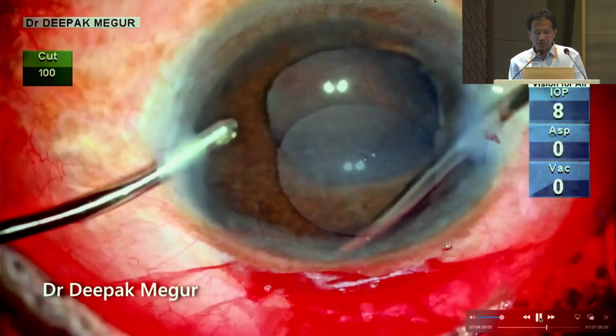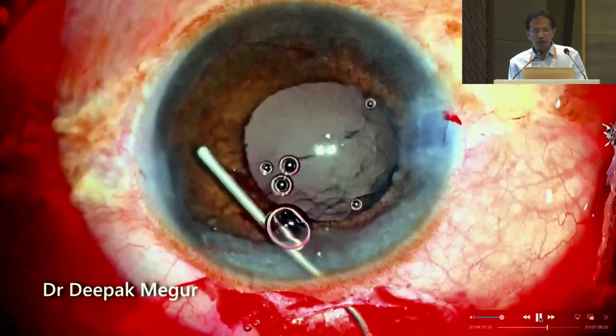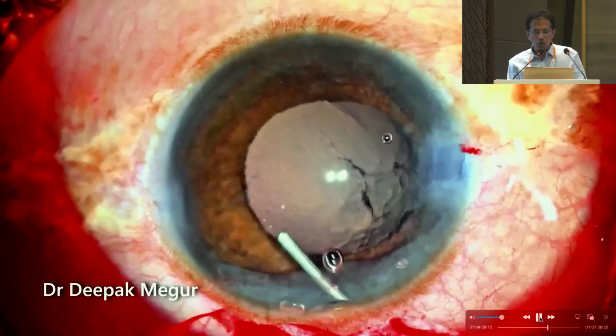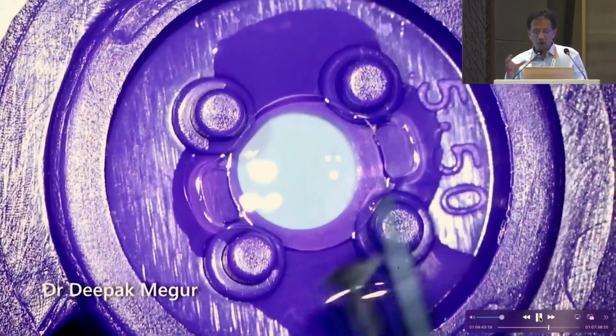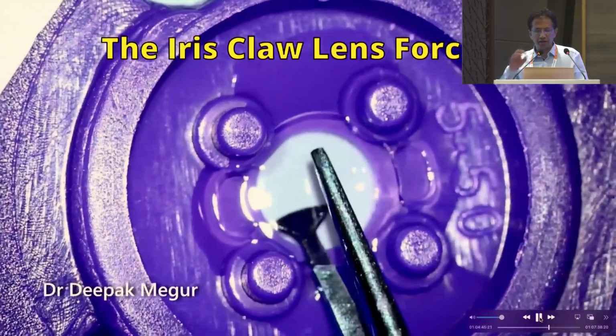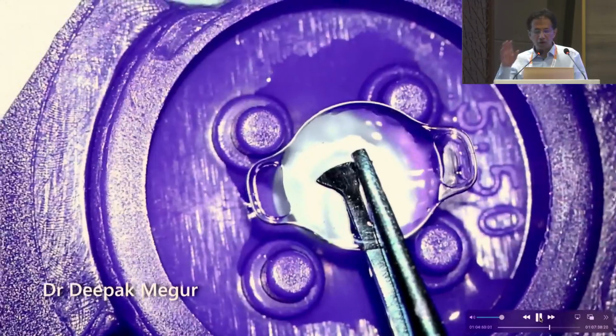This is again using a vitrector to just do a small iridectomy in the periphery. The pupil should ideally be mid-dilated. It should not be too small, maybe around 4 millimeter, 5 millimeter. And again, I'm forming the chamber with viscoelastic because, as I told, in a vitrectomized eye the eye is very soft. The moment you go inside, there'll be corneal folds.